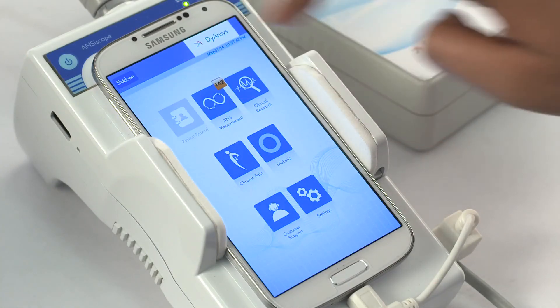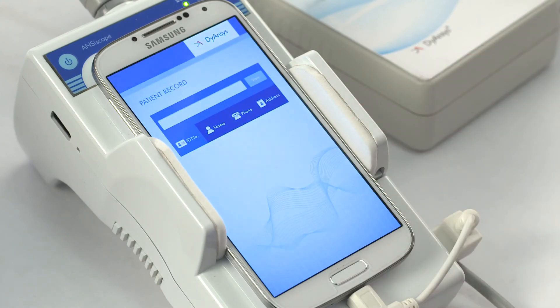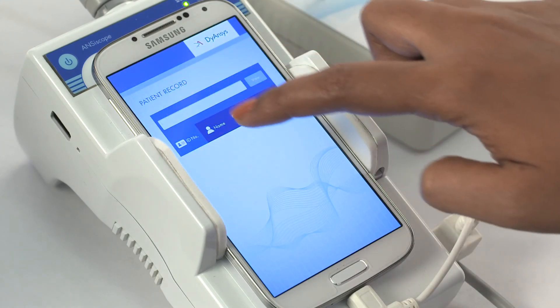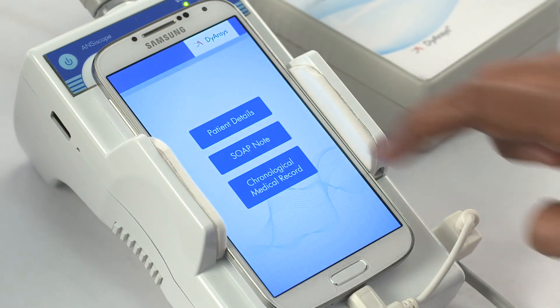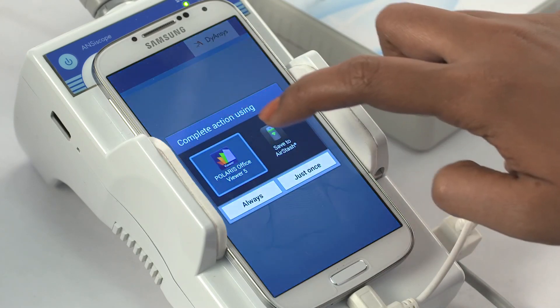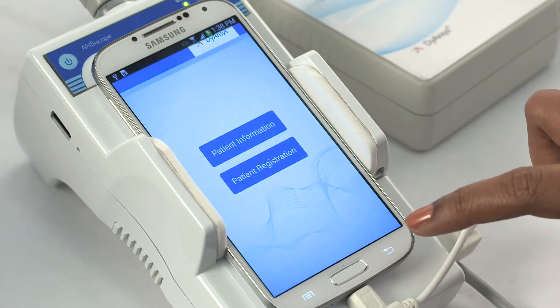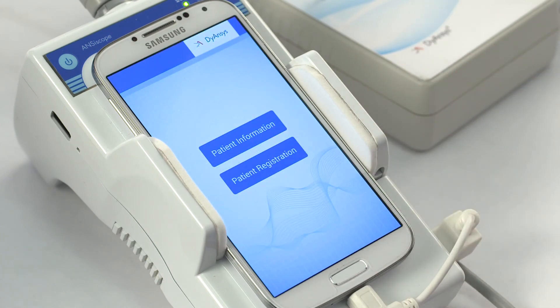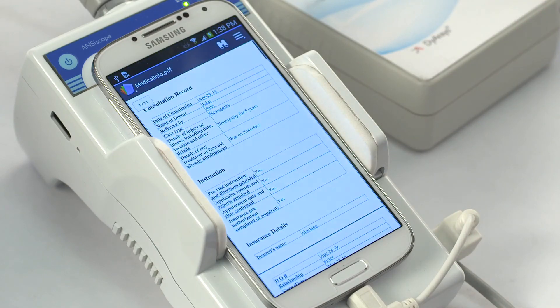View the results. Select the patient record. Choose existing patient. Search by ID, name, address, or phone number and select the patient from the list. Choose patient details and select patient information to view the demographic data. Then go back. Select patient registration details to view all data saved in the patient record.